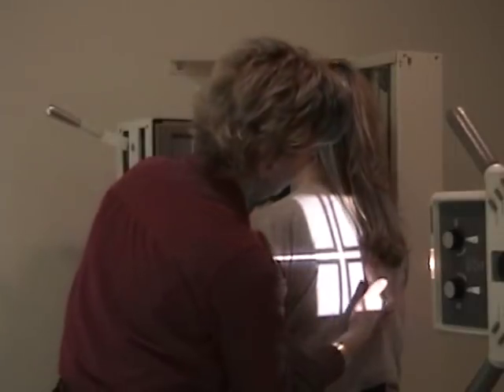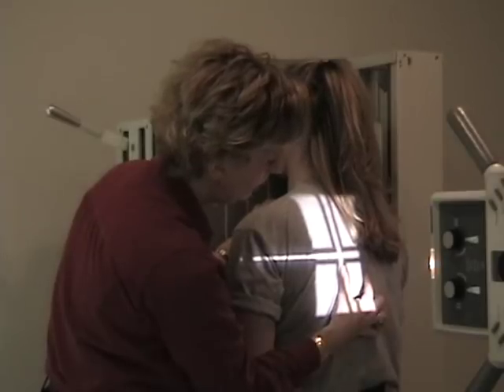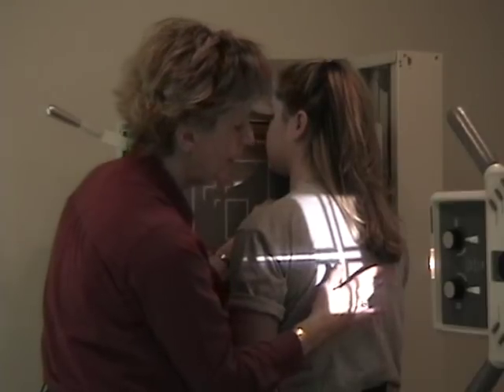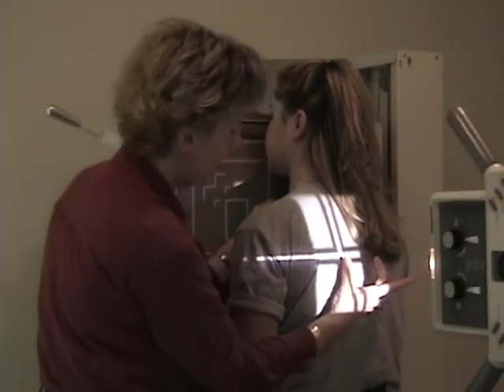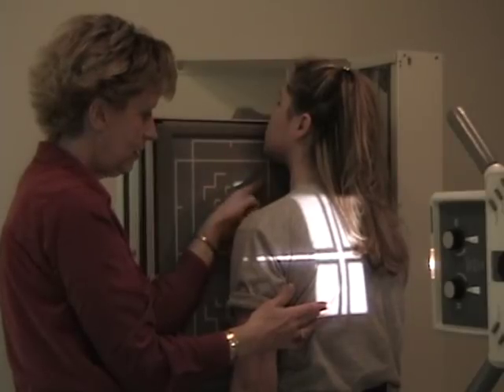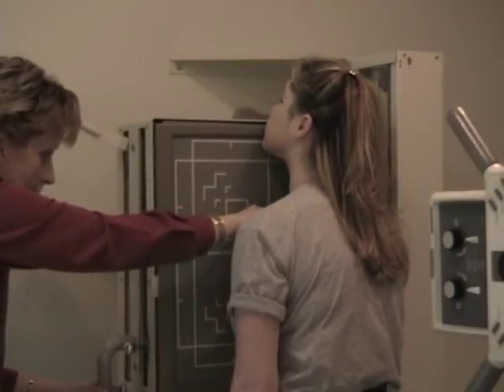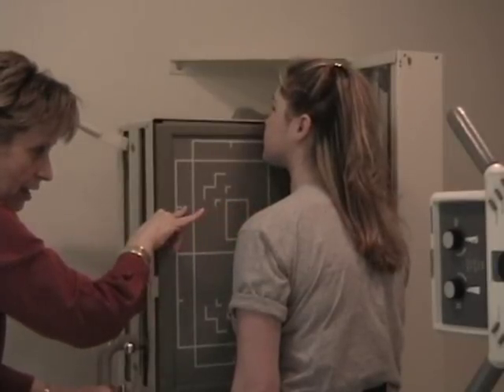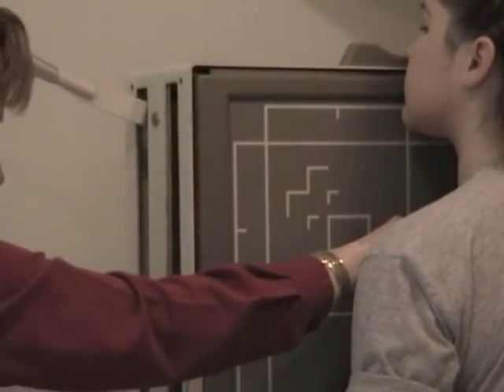You can also use the spinous process on a patient's back. See, here's the spinous process. And you're approximately 2 to 3 inches off of the spine. Again, the amount of being off of the spine will be determined by the degree of obliquity. But between knowing you're about 2 inches off of the spine there and seeing the placement of the manubrial notch being a little bit on that side of the center, you're happy with the centering. The height-wise of the board, I'm going to use the manubrial notch. This is what I'm trying to do here. Find the manubrial notch and then evaluate the film's edge to be 2 inches above the manubrial notch.